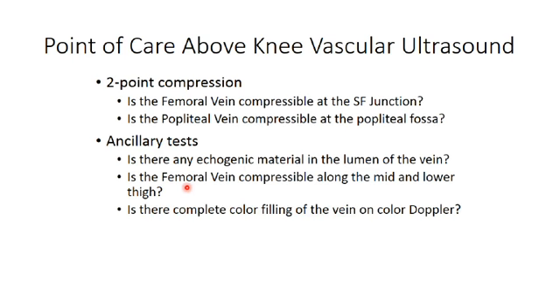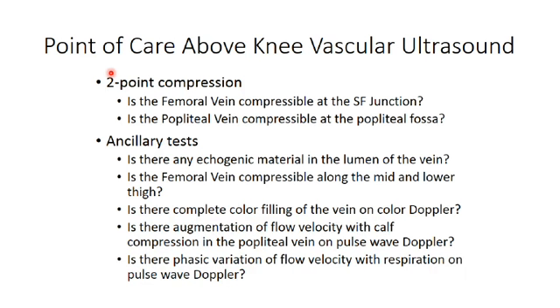Then on color Doppler, is there a filling defect, or is there uniform filling? And then on pulse wave Doppler, do you have augmentation of flow velocity with calf compression, and do you have a phasic variation on respiration? These are the 5 ancillary tests that you do.